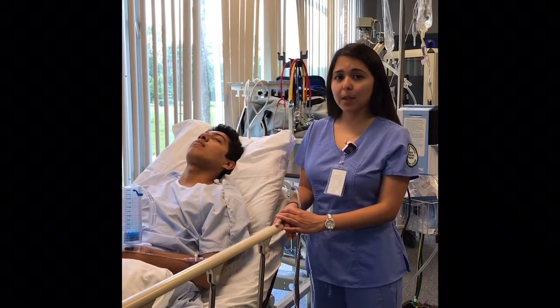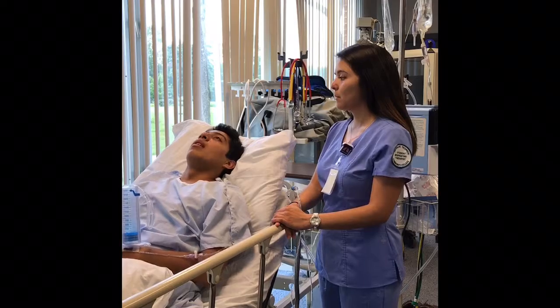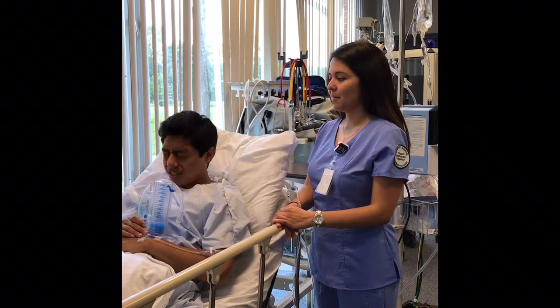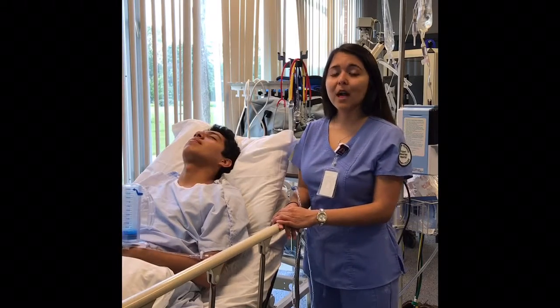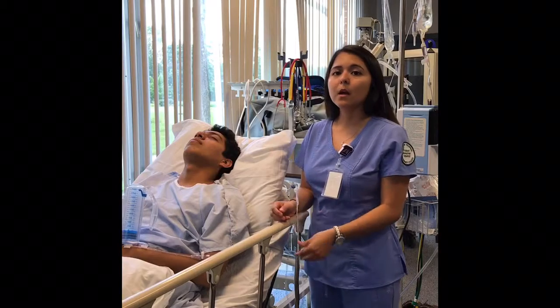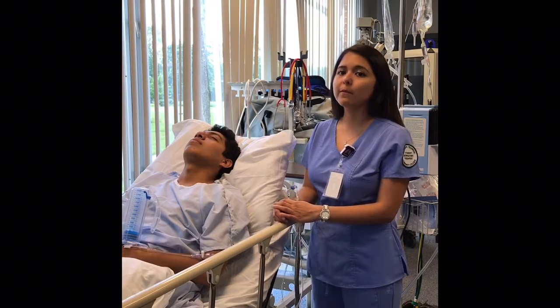Complications of IS therapy include hyperventilation, discomfort due to pain, hypoxia when interrupting the patient's oxygen therapy, a flare-up of bronchospasms, or extreme fatigue.